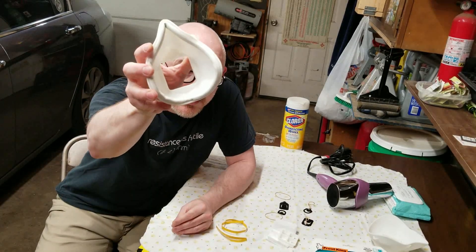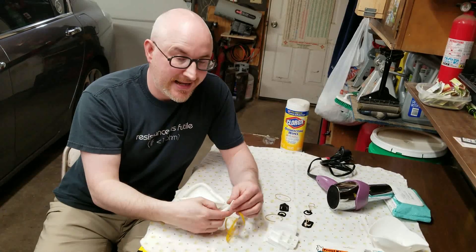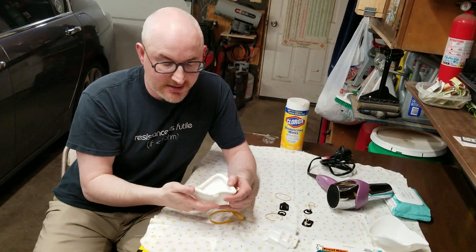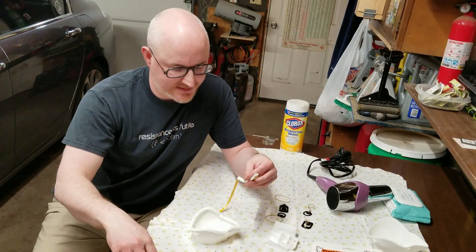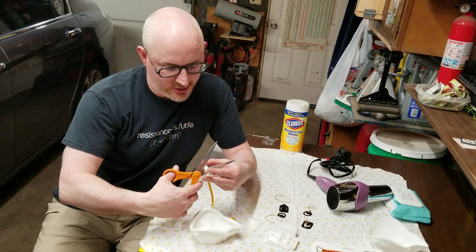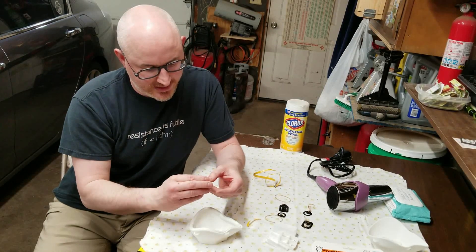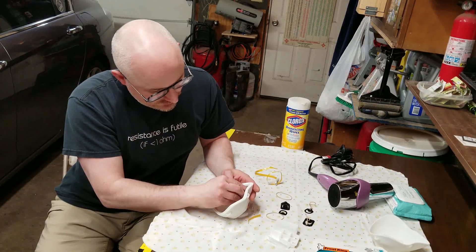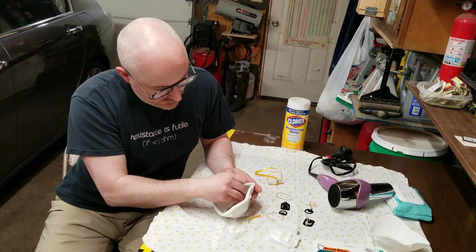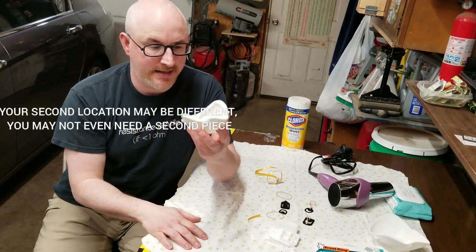So now you're left with a seal all the way around the mouth. The next spot you need to add some is the bridge of the nose, right up in here. If you test-fit it, you can feel there's a little spot where your nose might touch for prolonged periods of time. So you're going to cut a section and apply it right on the inside, similar to before. Now you've got a nice double seal.